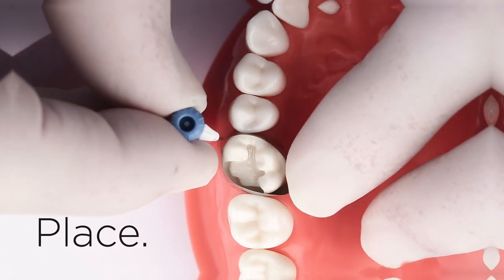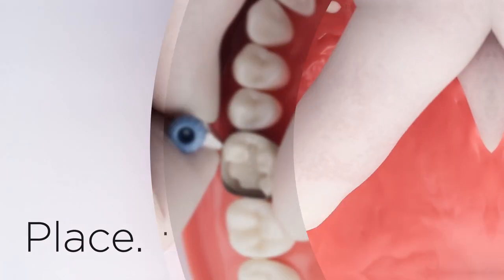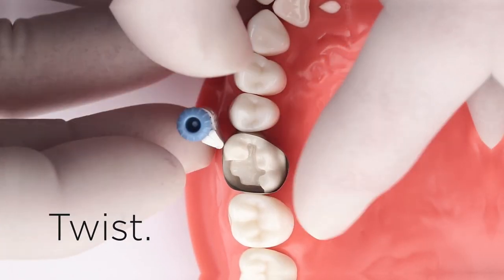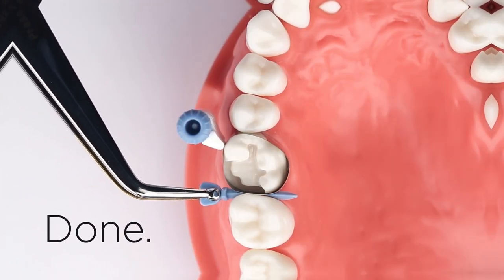Just grip the compact body and slide the band over the tooth using a downward oscillating motion. Adjust the fit by loosening or tightening the wheel with your thumb and forefinger. Insert a wedge to seal the gingival margin and you're ready to go.